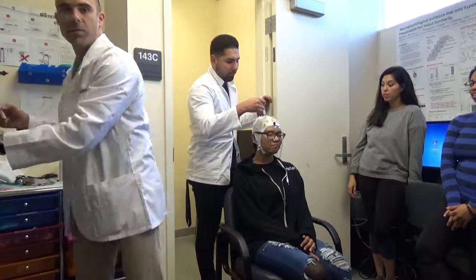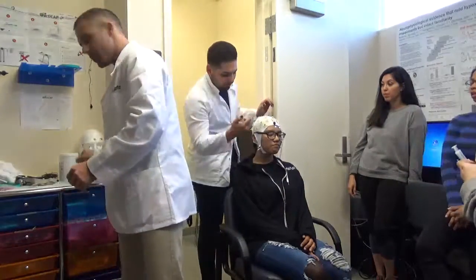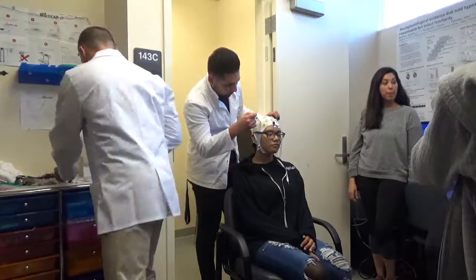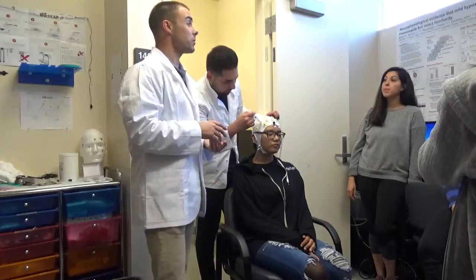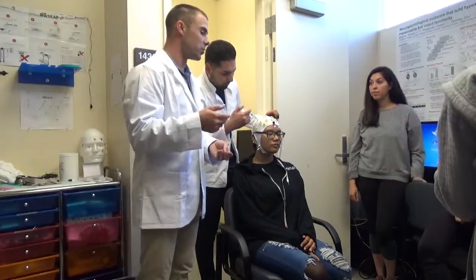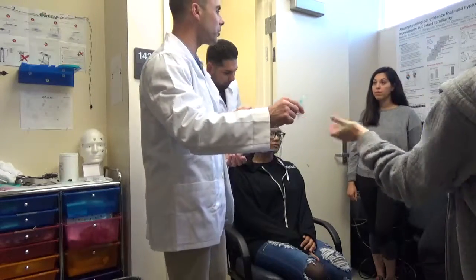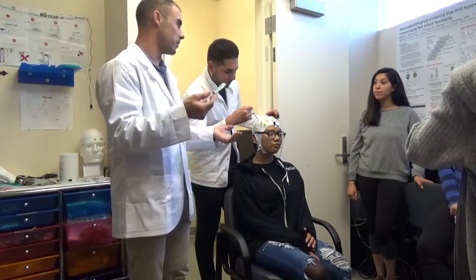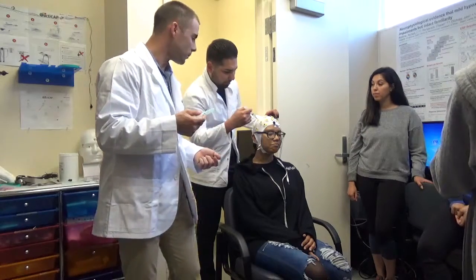And you guys want to fill that up for me? And then we can fill up this one. That one too? How many syringes per participant? One per researcher. Okay. So ideally when we conduct data collection, we can usually do it with 2 people. For our class, we'll probably do between 4 and 5 per subject. And so we would never use more than 1 of these per person.